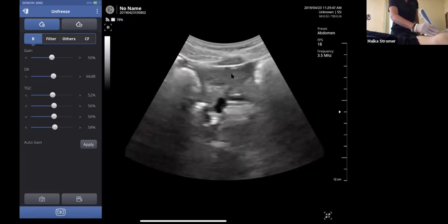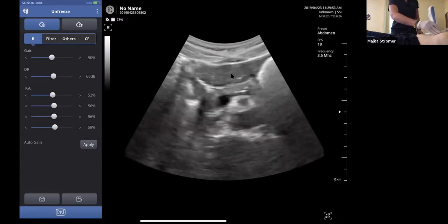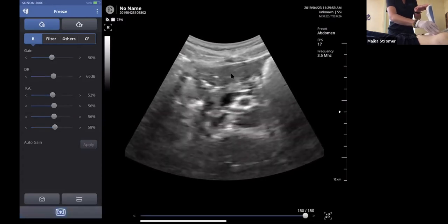Let's take a deep breath in and hold. All right, let's freeze right there. Beautiful. In this image here, what you're visualizing is aorta, IVC. You can actually visualize a portion of the left renal vein coming across the screen, and the SMA. Okay, so this is the area of the renal vessels. You can see that left renal vein just coming right off, laterally off of the IVC. So this would be the level that we're looking for any type of renal involvement, okay?